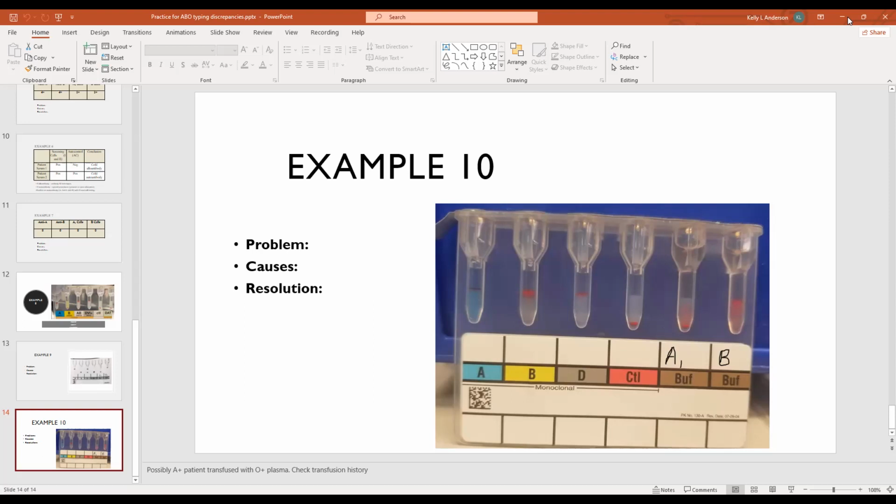You look so confused. I'll have to read about it, because isn't it something to do with the LISS and the zeta potential? That zeta potential is what prevents it, like, there's a bunch of negative charges around that cell. That's different, because in the ABO, you're not using anything like that. That is the function of LISS, low ionic saline. But in rouleau, it's just the plasma that you're removing for the saline replacement, because it's not actually bound.